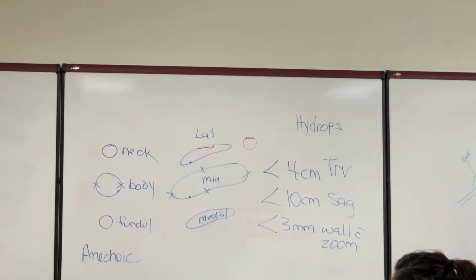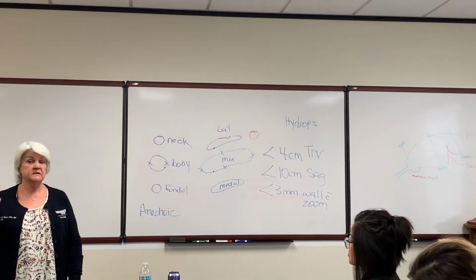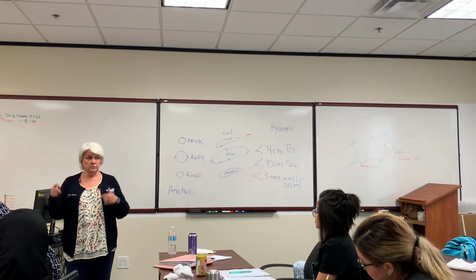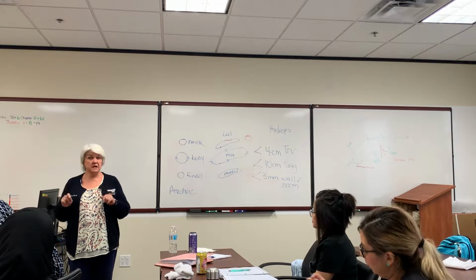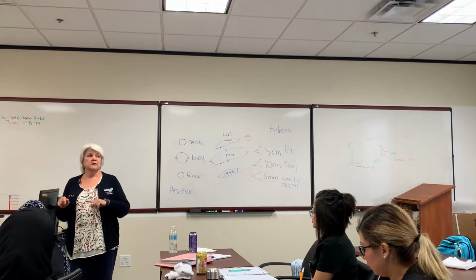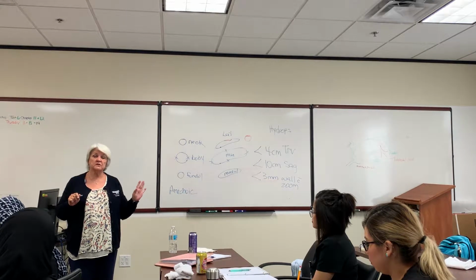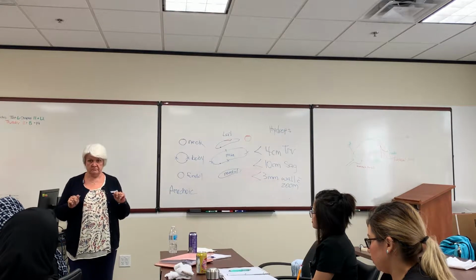what am I going to do? They just chatter. Because when patients get nervous, they chatter. Some people cry, some people talk, some people get really, really quiet. You'll learn the different personalities. But if I can't get them to stop talking, turn your head to the left. I need you to be quiet for just a few seconds while I look at this gallbladder. We want to make sure everything's okay. And then I'll show you what I looked at afterwards.